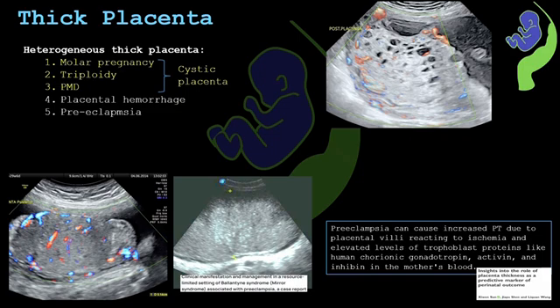When a patient comes with a history mimicking abruptio placenta, there may be increased thickness of the placenta due to hemorrhage, but we may not be able to differentiate between the echogenicity of the hemorrhage and the placenta, and this may be the reason that ultrasound is not sensitive enough to diagnose fresh bleeding in abruptio placenta.